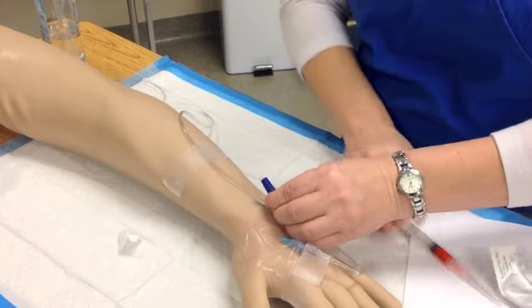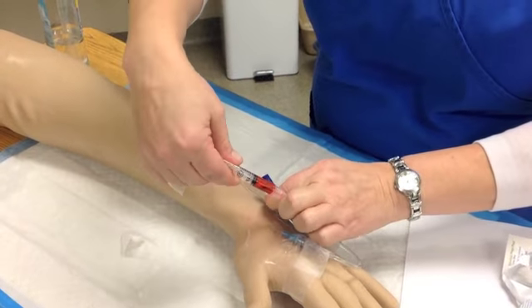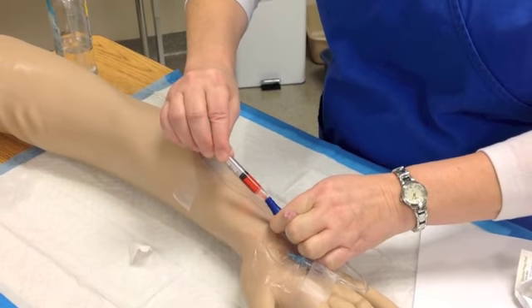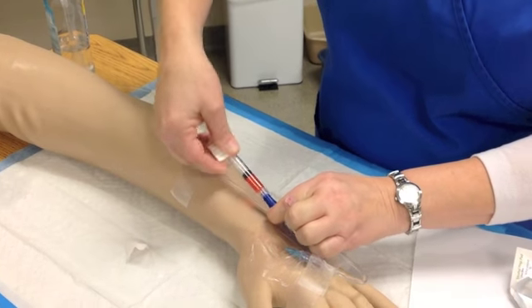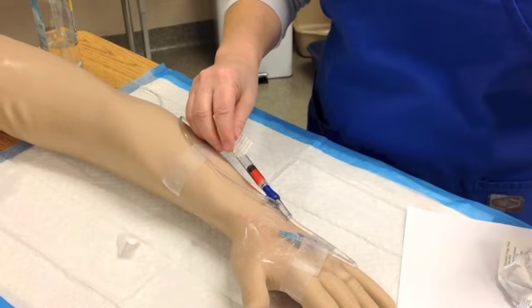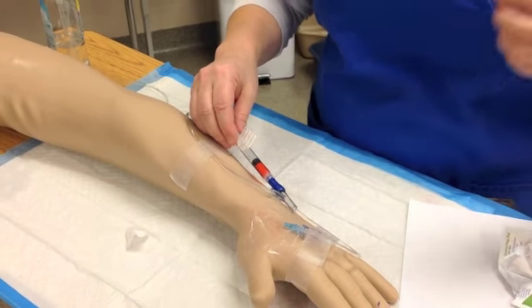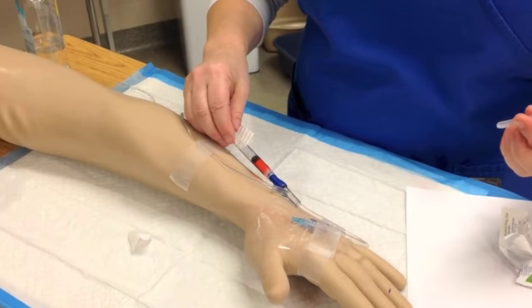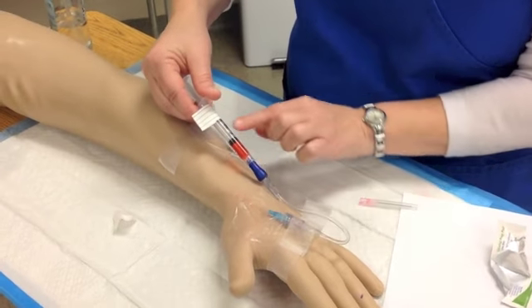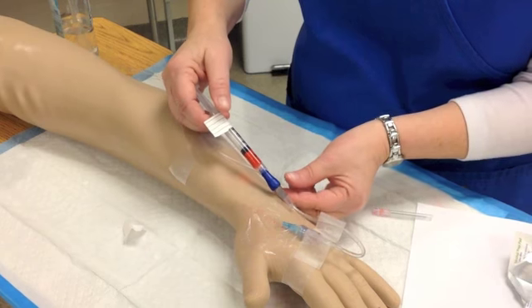Once we clean that, then we're going to want to hook our tubing on. So I'm going to take the needle off, and that's the reason this is capped, is to keep it sterile. So we'll push this on. And remember, we've done our calculation. So I'm going to push like 0.1, which is 1/10, and then I'm going to wait like 12 to 15 seconds before I push the rest. So make sure that you can see your graduated part on there. So I'm going to push 0.1.